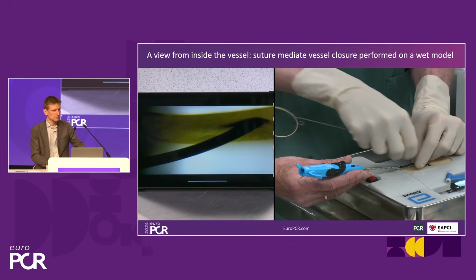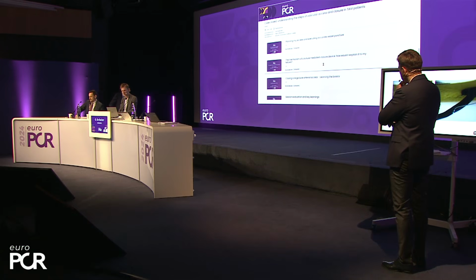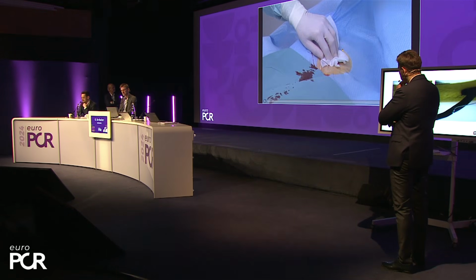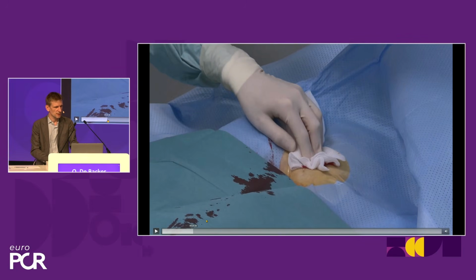So then you pull it out. So this is on the wet model. I think I had a real life example. So this is then the suture from inside, how it looks. This is in real life, yes. So let's see this quickly too. I'll go a little bit forward in time.